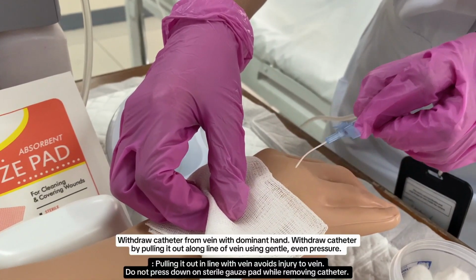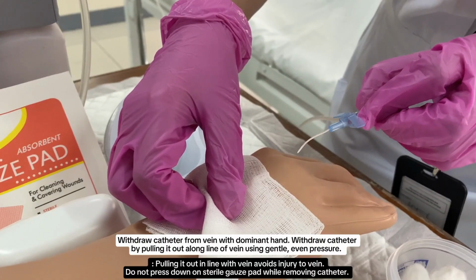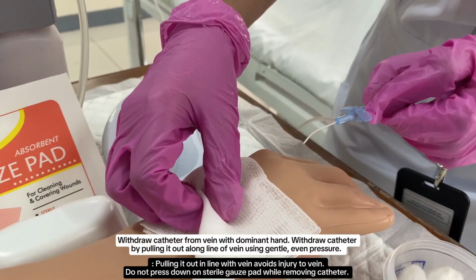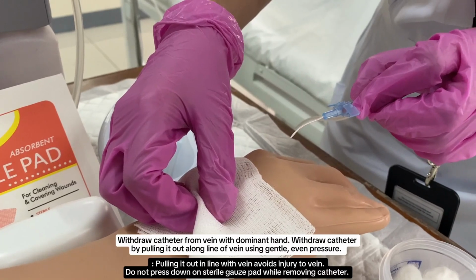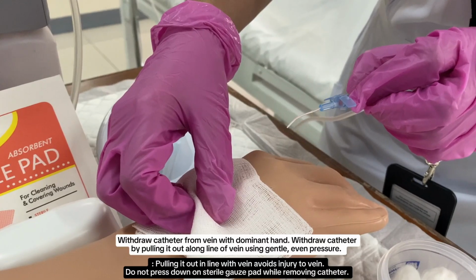Withdraw the catheter from the vein with the dominant hand. Withdraw the catheter by pulling it out along the line of the vein using gentle, even pressure. Pulling it out in line with the vein avoids injury to the vein. Do not press down on the sterile gauze pad while removing the catheter.